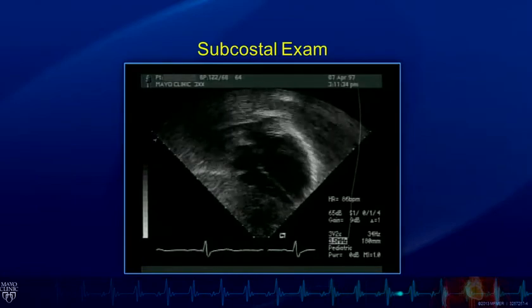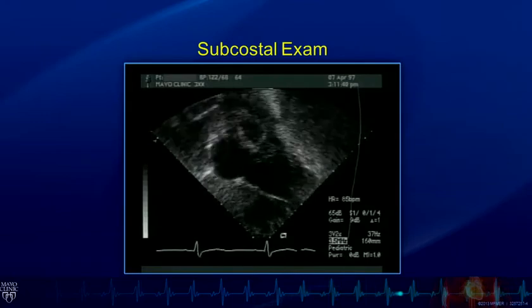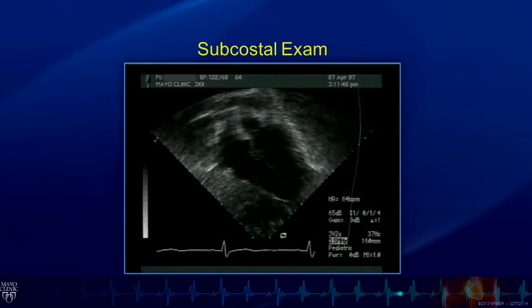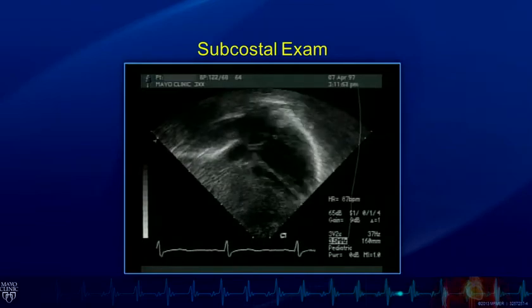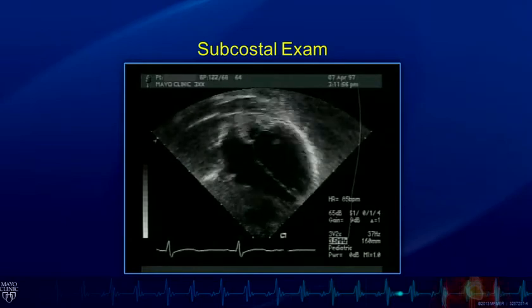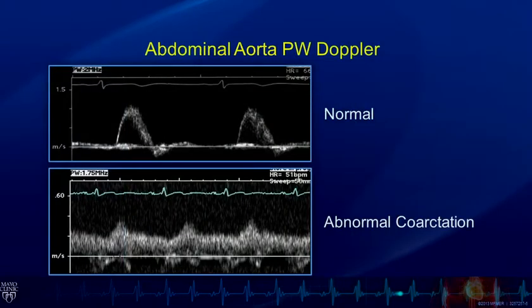Apex down format is generally used in the assessment of patients with congenital heart disease, and we'll look at all apical images in an apex down format, and that just helps us to determine the orientation of the heart. And here in a normal orientation, that's upper right to lower left, we know that this patient has levocardia and situs solitus. Additional information, of course, can be obtained from the subcostal format, but we'll look at some additional details shortly.